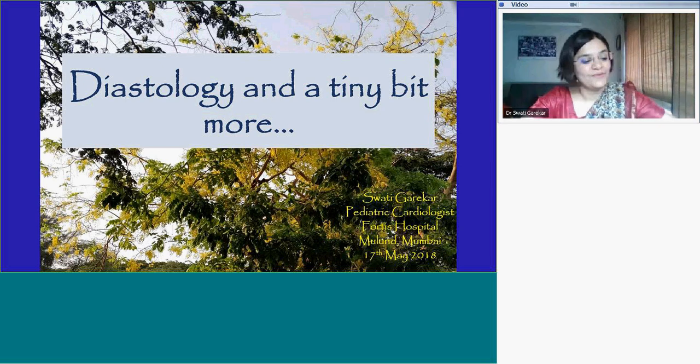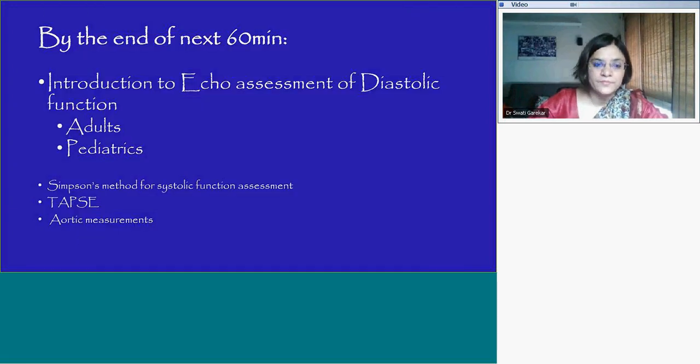It's been a hot May, and we are out to tackle a hot topic, that too in just 60 minutes, and some other questions by co-fanatics. So see what all we can cover. Have introduction to assessment of diastolic function of the left ventricle, adult and pediatrics, and at the very end we will touch upon Simpson's method for systolic function assessment, see aortic measurements, and any other questions.